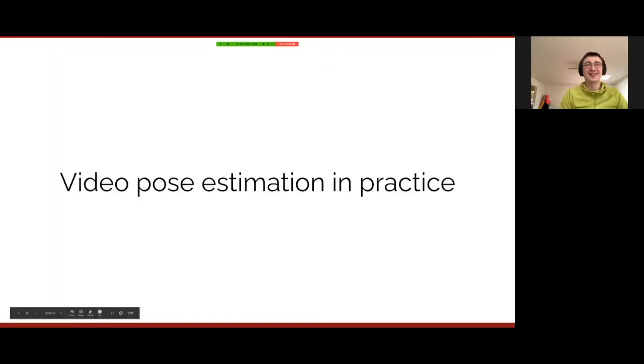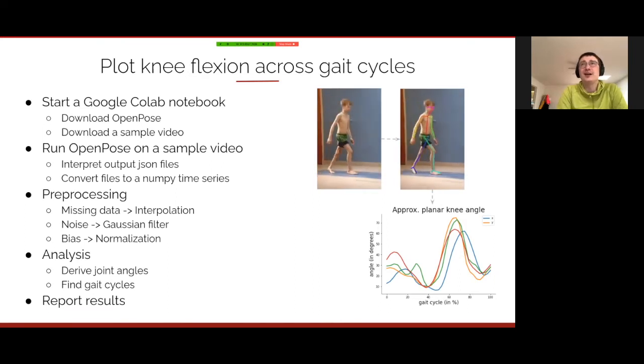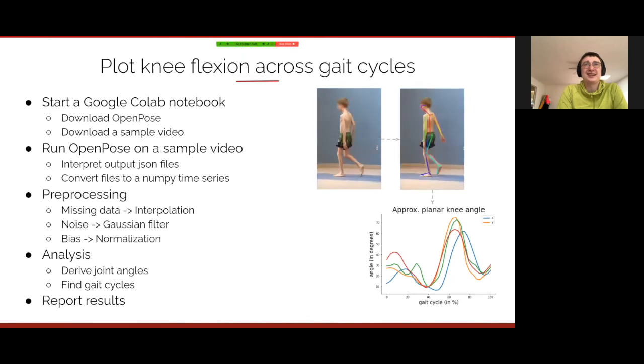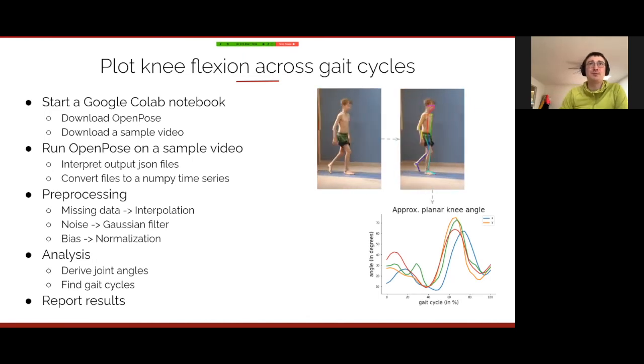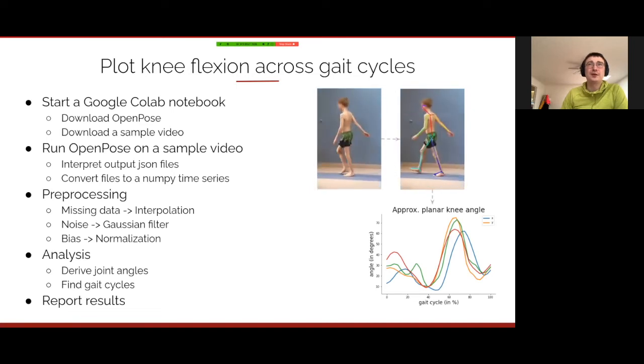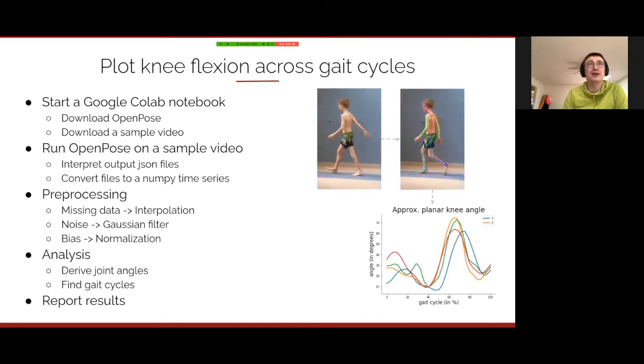Perfect. Thank you again for the introduction and the invitation. Let me jump in and start directly with the plan of the second part of the webinar. We have around 15-20 minutes for the presentation slash tutorial part. I'll go quickly through many points, but you already received a link to a notebook with all the information, and it's a self-contained lesson on how to use OpenPose that you can run without me talking.